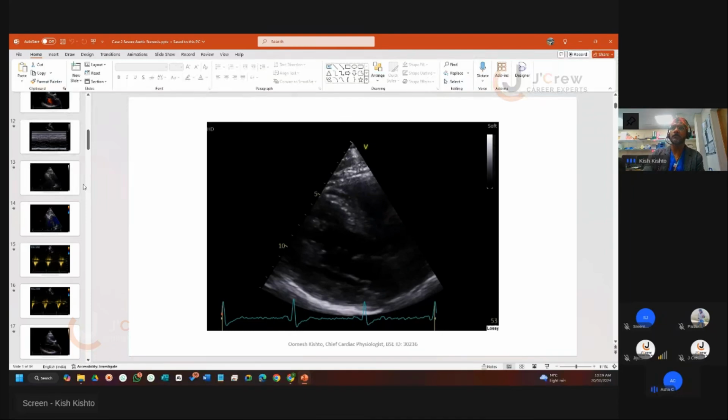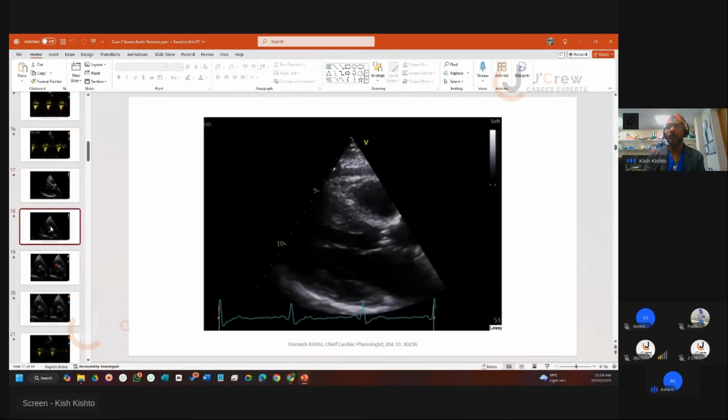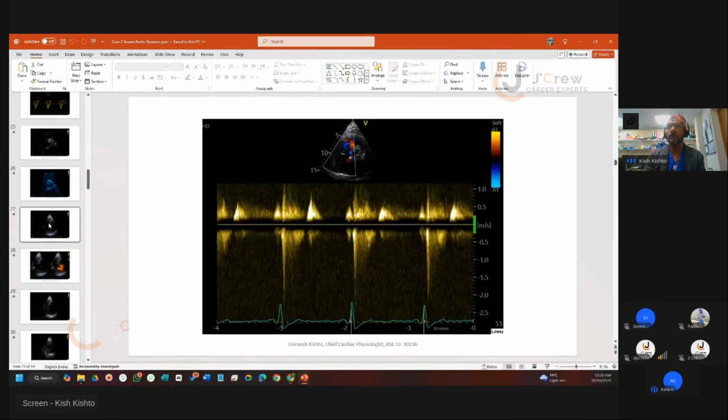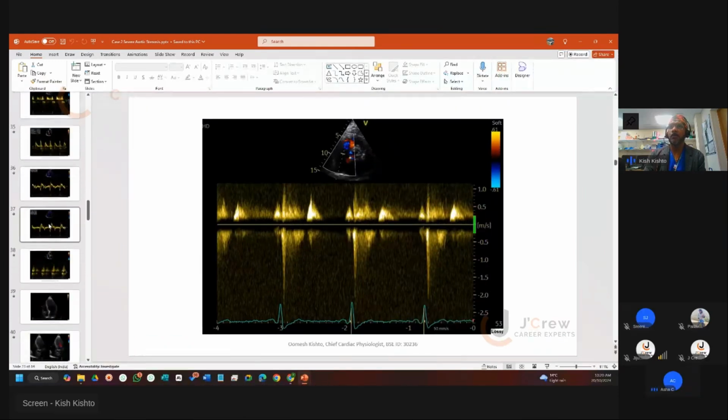And based on the valve morphology, if the valve is sclerosed, we cannot get the correct measurements of aortic stenosis, right, sir? Or is there any way to get it? I have seen detailed echo reports that mention the AV is sclerosed, and the measurement could not be obtained correctly sometimes. It is not accurate.